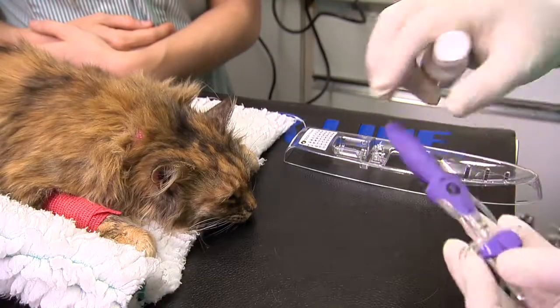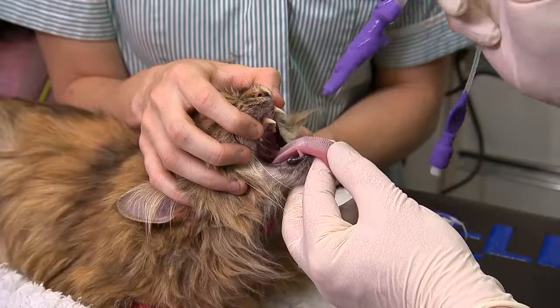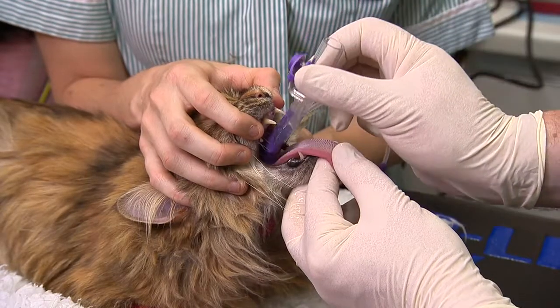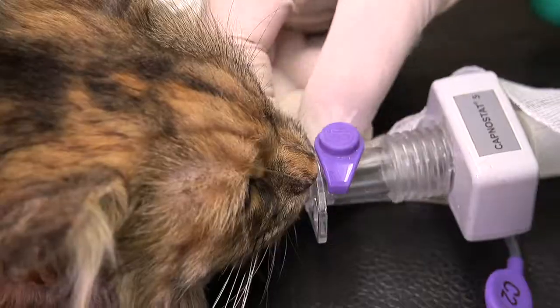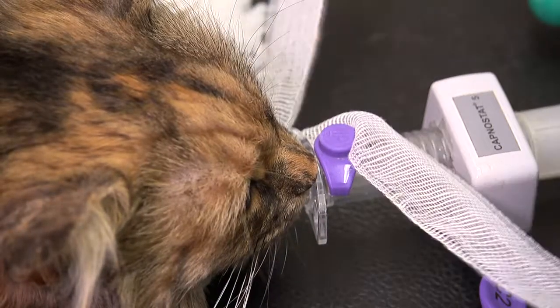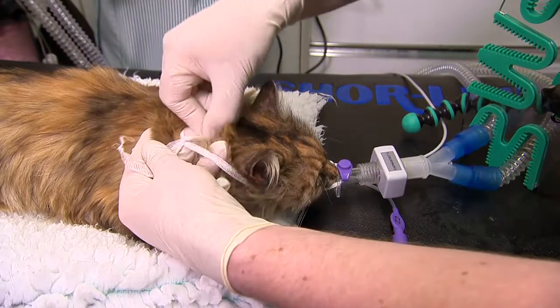The patient should be anaesthetised and the V-gel lubricated and inserted as described in our user guide and shown in our other videos. Stabilise the V-gel by tying it in place with the V-tie. The D-grip can also be used as shown.